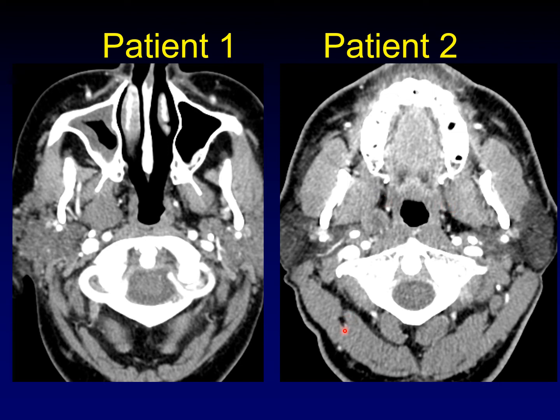These patients both have pleomorphic adenomas, but they arose from different sites. In patient two, this is an exophytic pleomorphic adenoma coming off of the deep lobe of the parotid and displacing the parapharyngeal fat. In patient one, this pleomorphic adenoma arose from rests of salivary tissue within the parapharyngeal fat and is displacing the parapharyngeal fat in all directions. It is separable from the underlying gland.